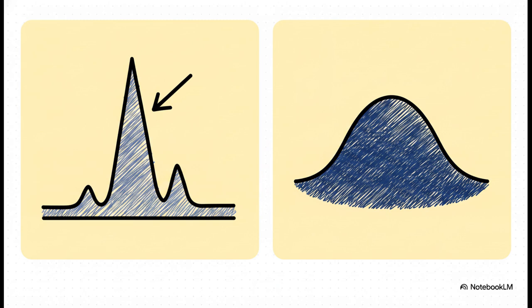Peak gradient is the maximum instantaneous pressure difference. We calculate it using the absolute highest single velocity point recorded during the cardiac cycle. Think of it as the worst moment of blood flow.